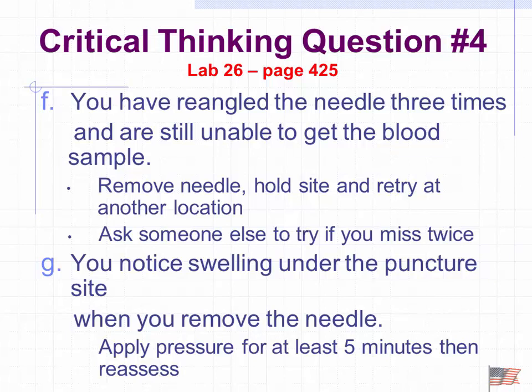You've re-angled the needle 3 times and are still unable to get the blood. There's something else wrong. Remove the needle. Don't continue to go fishing, as Stacy said.